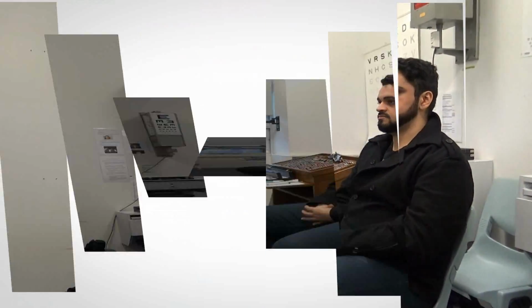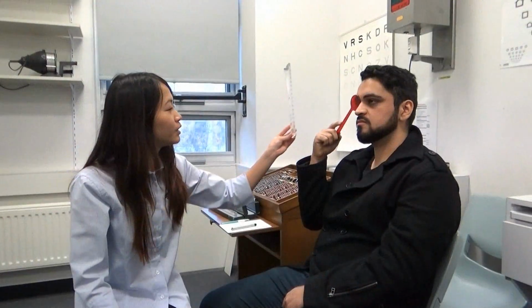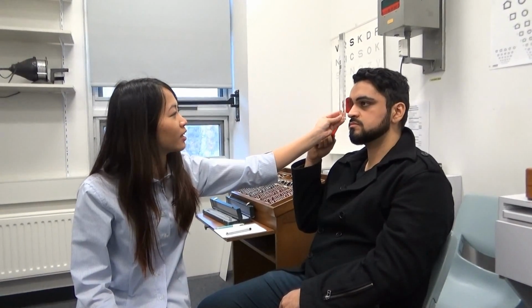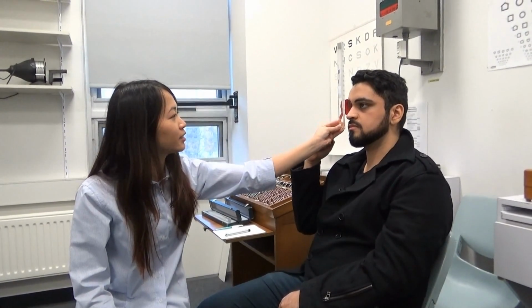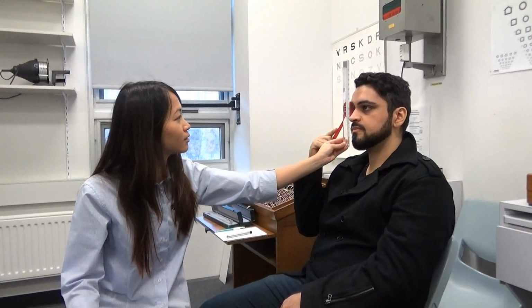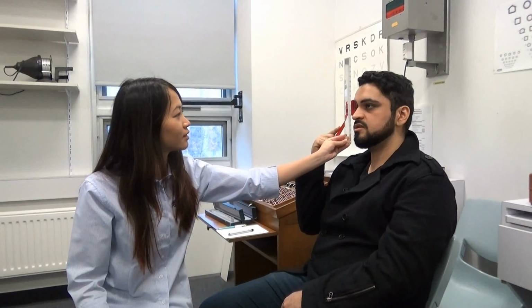So now I'll be conducting this test again, but in distance. I'm just going to be turning on the light. So where is the light in regards to the vertical red line? It's on the right. On the right? Yep. Okay, so now I'll be putting the prisms against your right eye again. Tell me when the light goes over the red line. Is it getting closer? Yes. So right now? It's on the line. Okay.